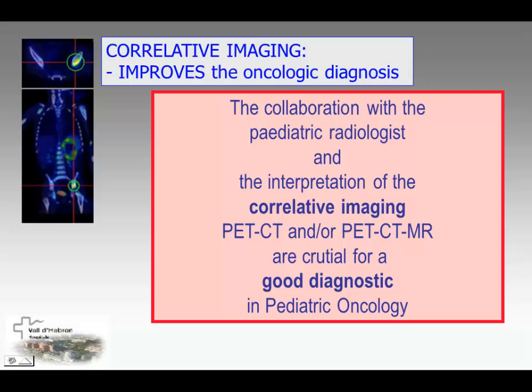Yes, but what will the PET add over the MRI, especially given the nature of these diseases, with exacerbations and remissions? Well, with PET you can perform, if you want to see the bones, a PET with fluorine, or if you prefer to see the inflammation, you can perform a PET with FDG. With FDG PET, you can detect more easily the areas of inflammatory disease in the articular areas.